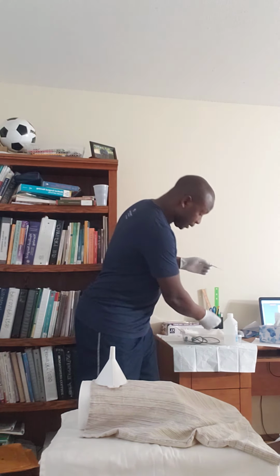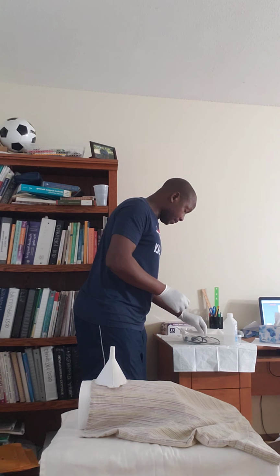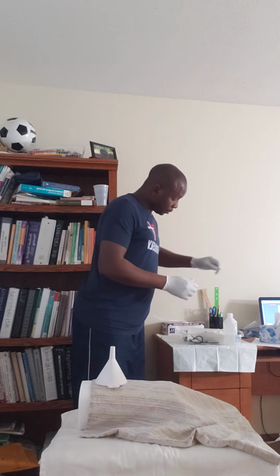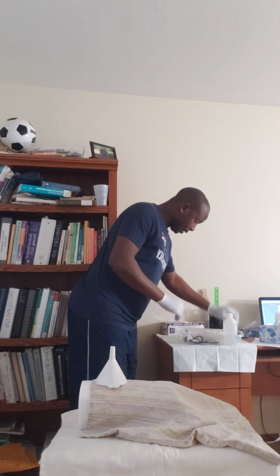Since my cannula is in the water, I'm going to clean my cannula inside. I remove them. My cannula is small. It's just like this. So then I'm going to clean it. I'm going to put it in the water over here, clean it, remove it, and then put it into another, because the kit has a different one. This is now the second kit over here.